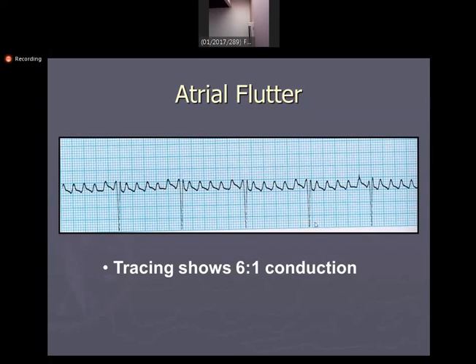Segment and interval. Okay, cardiac axis from R. From R, you can come to my office because it is a very detailed topic, how to calculate the axis. If you come to my office, I will tell you there.